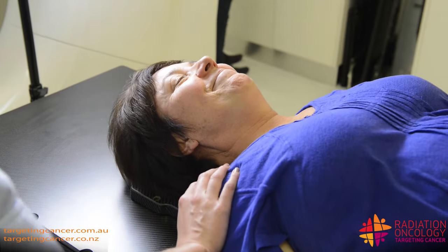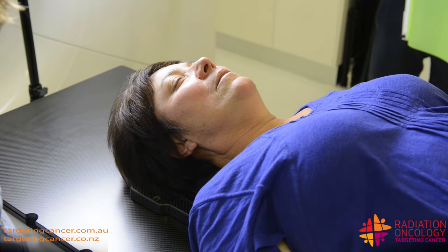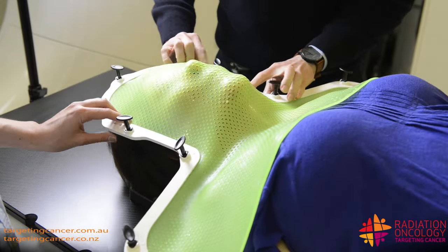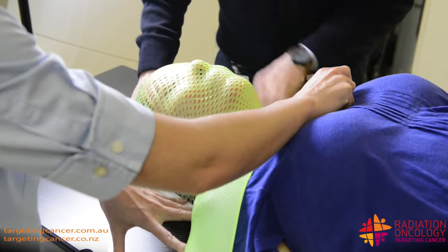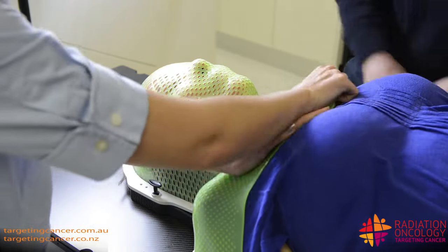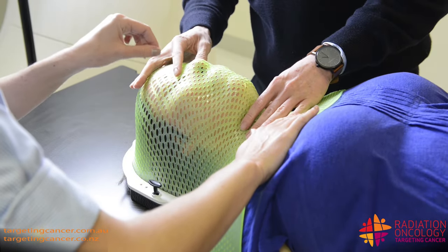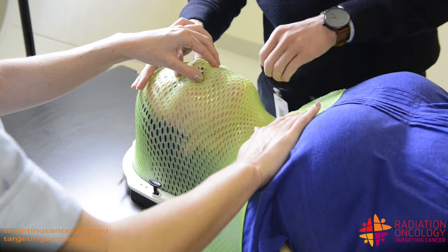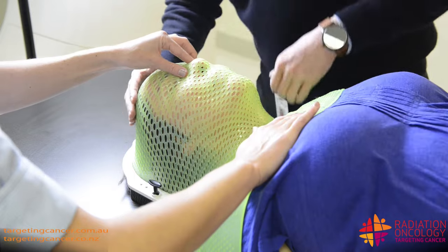It's going to be quite warm and wet but it just feels like a wet cloth. So just breathing normally. Feeling okay? Yeah. So this will take a few minutes to cool and harden. What I'm going to do now is bring over a wet cloth and then I'll just speed up that process a little bit more.